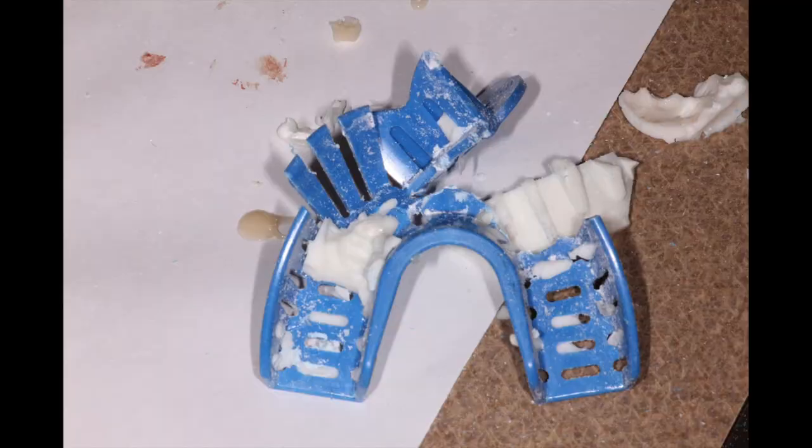After we let that set, we removed it, but the temporary material had stayed inside the preliminary impression. It was pretty well locked in there, so we had to destroy the tray in order to relieve the material from the impression. We had one shot to get it right — if that didn't work, we'd have to come up with an alternative plan.